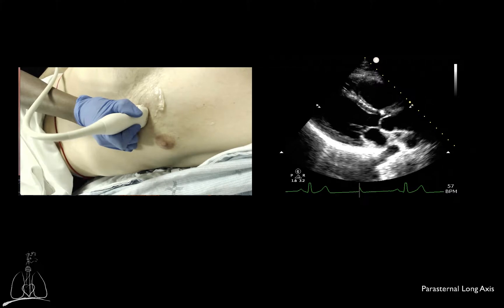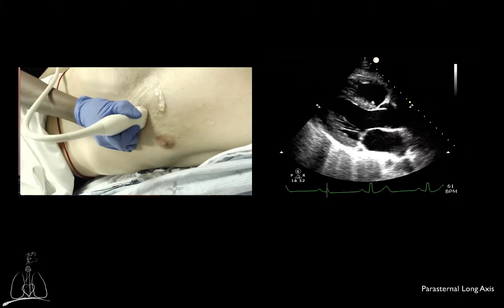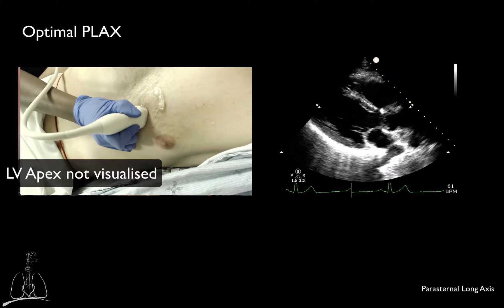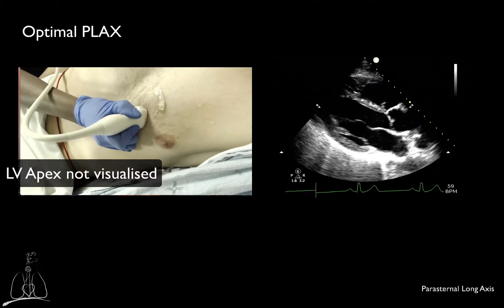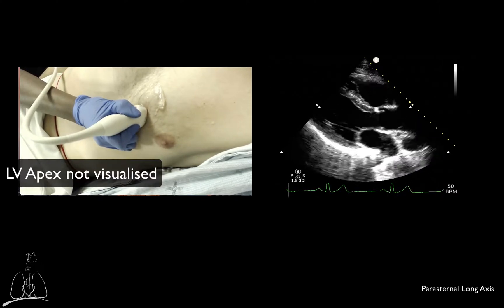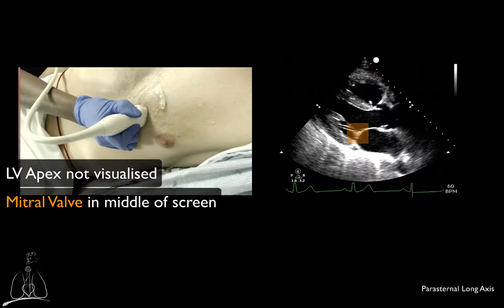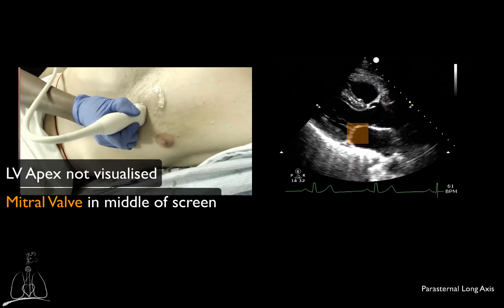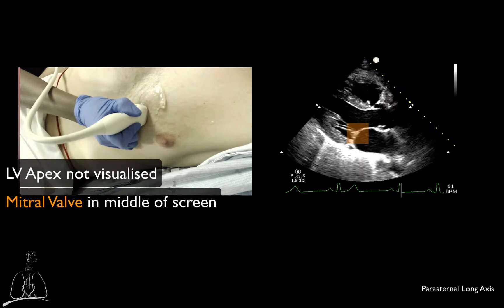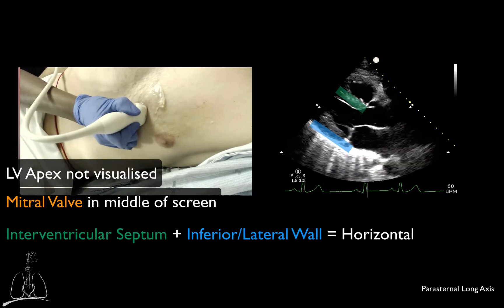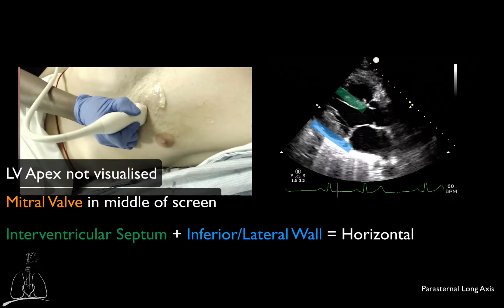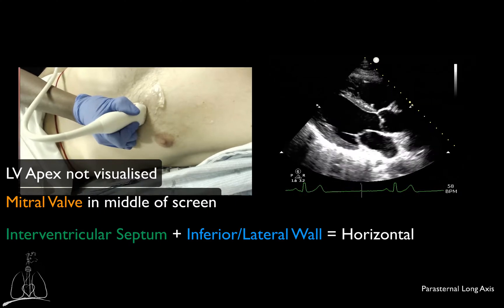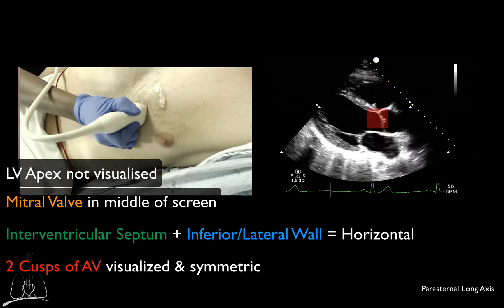The criteria for an optimal parasternal long axis view are the following. The apex of the left ventricle should not be visualized. The mitral valve should be positioned in the middle of the screen, with the aortic valve slightly positioned on the right. The interventricular septum and the inferolateral wall should appear horizontal. Two cusps of the aortic valve should be clearly visualized and appear symmetric.